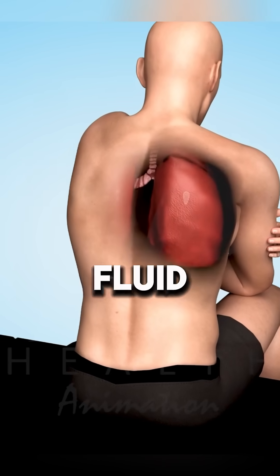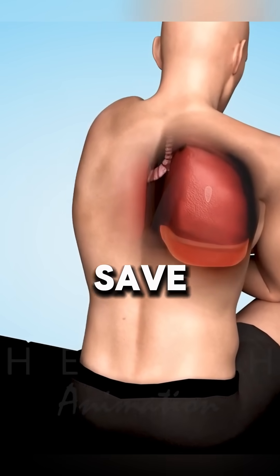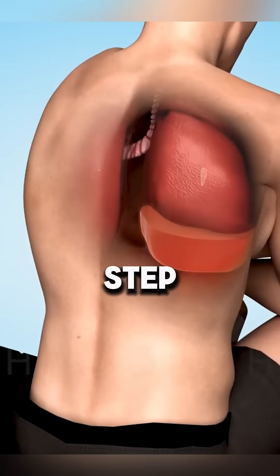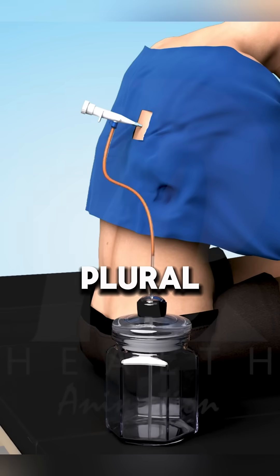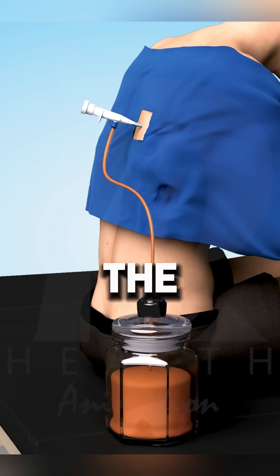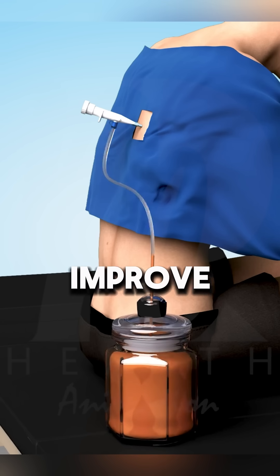Ever wondered how doctors remove fluid from your lungs? Save this video to see how thoracentesis is done step by step. Thoracentesis, or pleural tap, is a procedure where a doctor drains excess fluid from the lungs to relieve pressure and improve breathing.